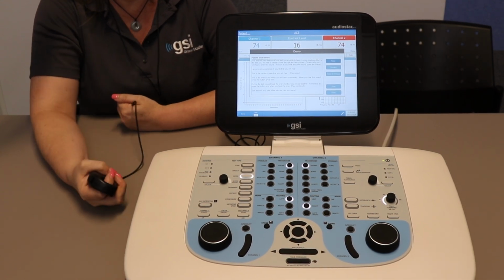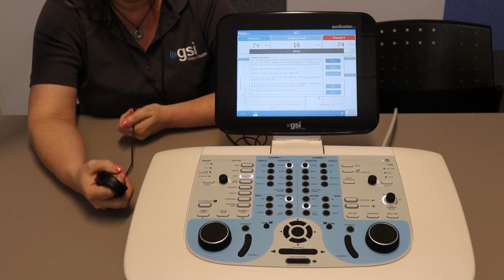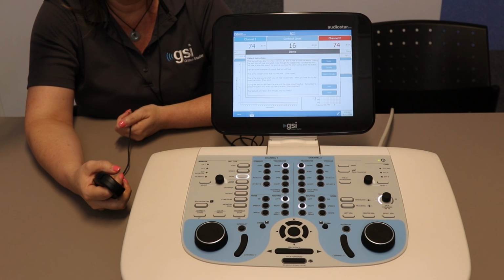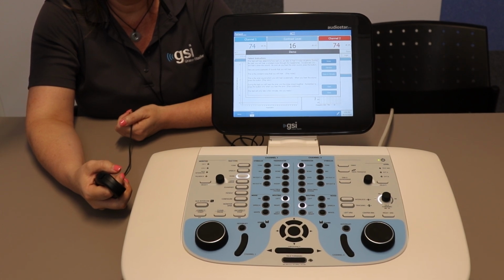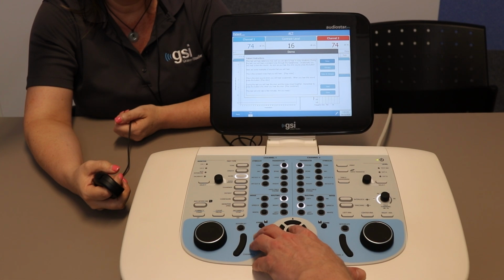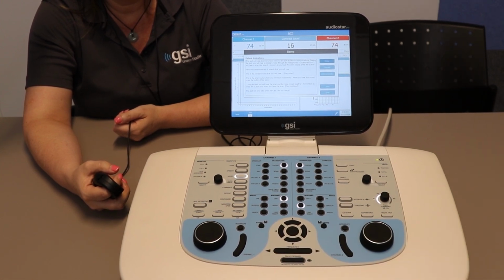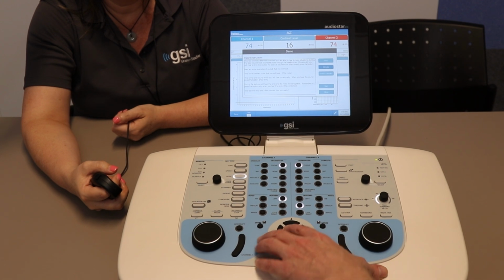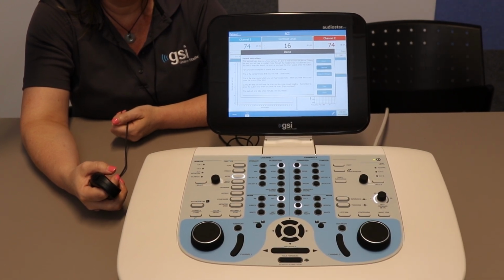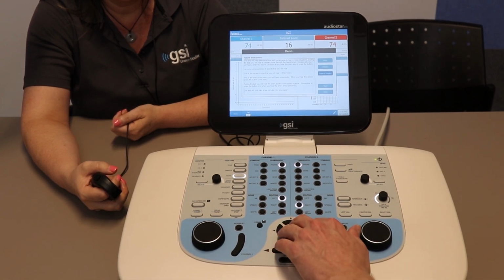There's a demo dialog box that pops up, which allows you to demo this for your patient. So you want to explain to the patient, you're going to hear some stimulus and some noise, and I'm going to play examples of them for you, starting with the noise. I'm going to press the circle button here to get a demonstration of that noise. So now Laura heard the noise in the headphones, and now the stimulus. The best way I can describe this is kind of like a siren type sound. And then Laura, this is the noise and the stimulus together.